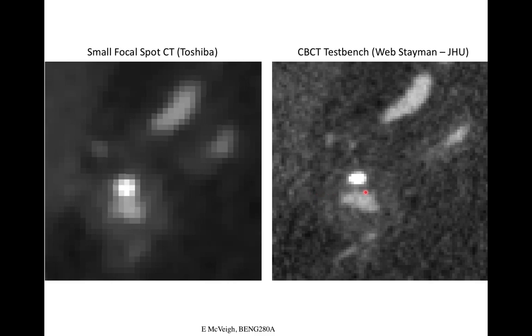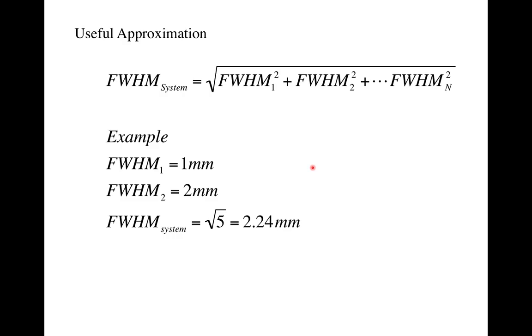But I think if you wanted to quantify how much calcium was there, you'd pick this data, right? If you're going to integrate up pixels and figure out just how many grams of calcium I have in there, you'd probably pick this, the high frequency data. So this is a hint, like a useful approximation.